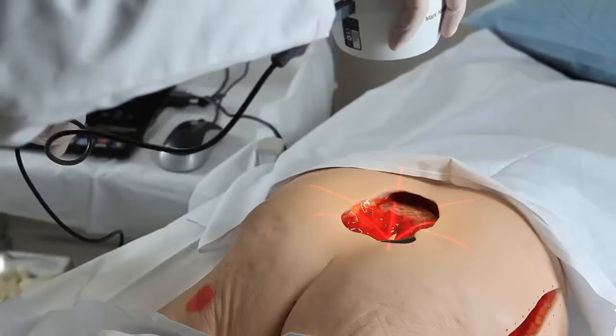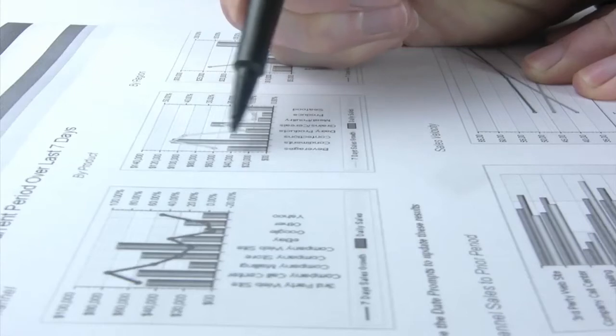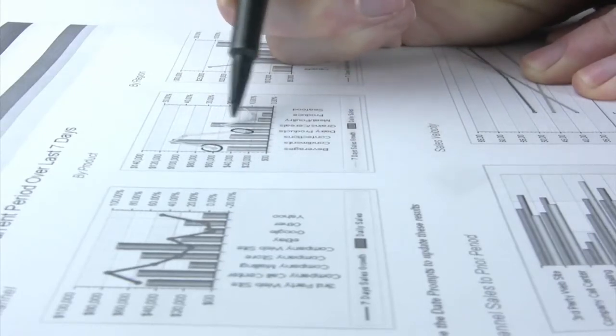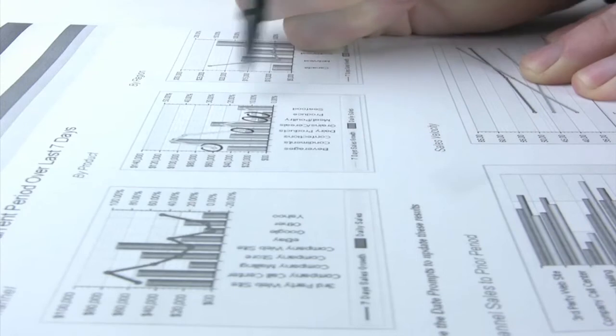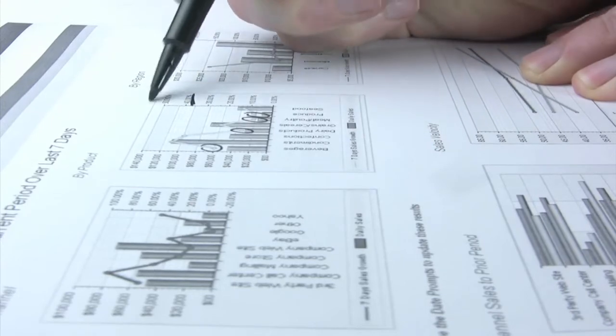Reduce patient discomfort and use Silhouette feedback to increase compliance with care plans. Silhouette's insights support better decisions that may free up bed days and reduce unnecessary readmissions.